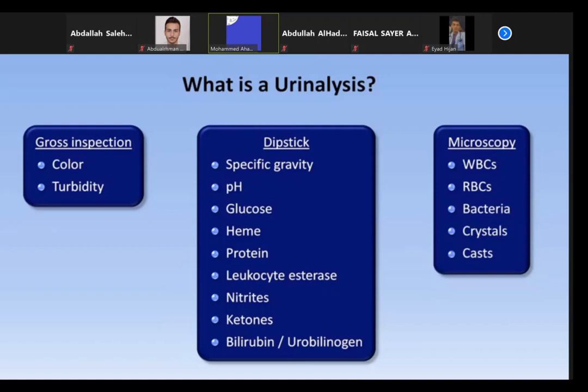I'll be talking about microscopy in the last video, which will also include a summary of how to put all this together in order to use the UA when making diagnoses. For the remainder of this video, I'll be focusing on just the gross inspection of urine.